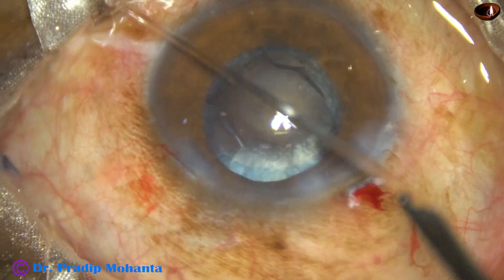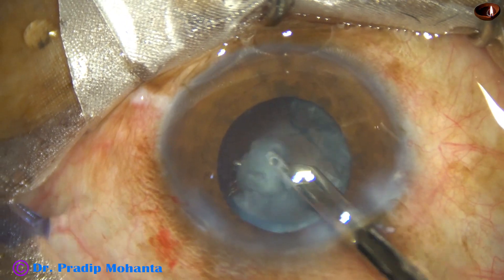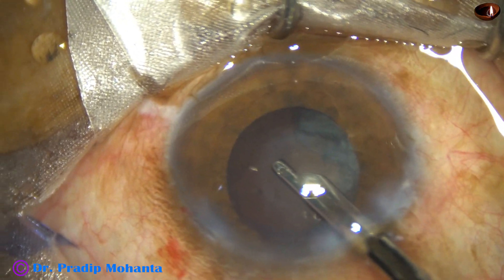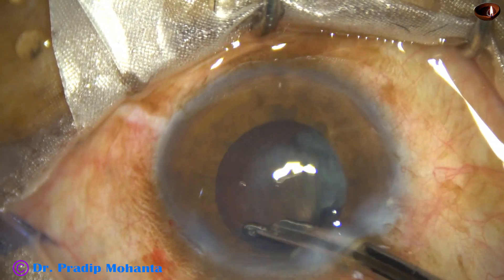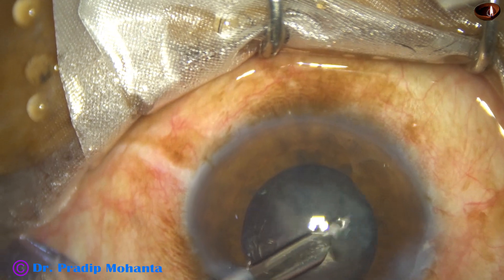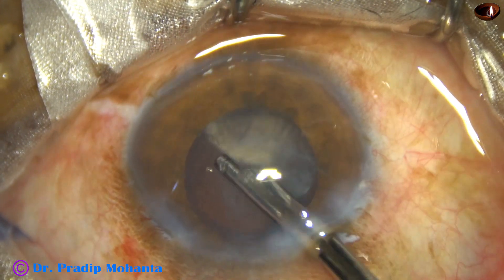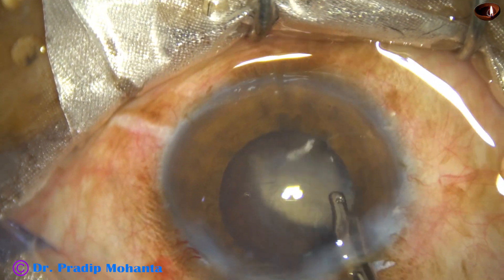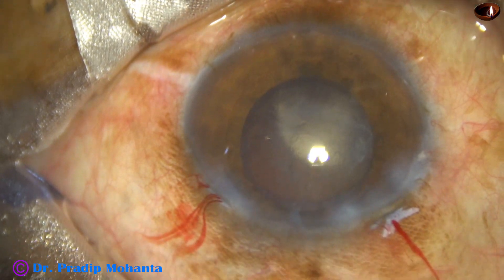Now the cortex is removed by this Simcoe cannula. Whenever there is silicone oil, the posterior capsule gets fibrosed at the central part, most of the time. It becomes so thick that it cannot be pierced by a YAG laser. So during removal of the silicone oil, the vitreoretinal surgeon cuts the posterior capsule at the center, making an opening with the vitrectomy cutter in the central part of the fibrosed area.